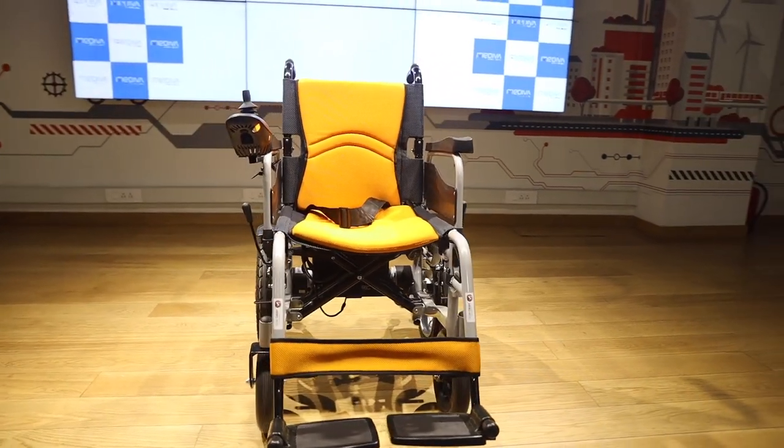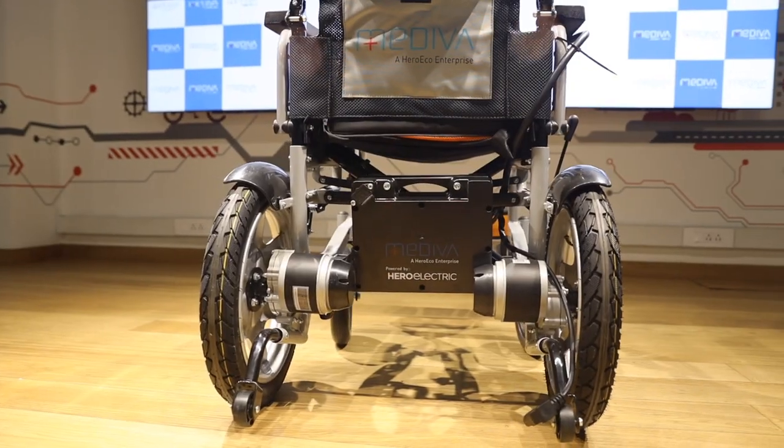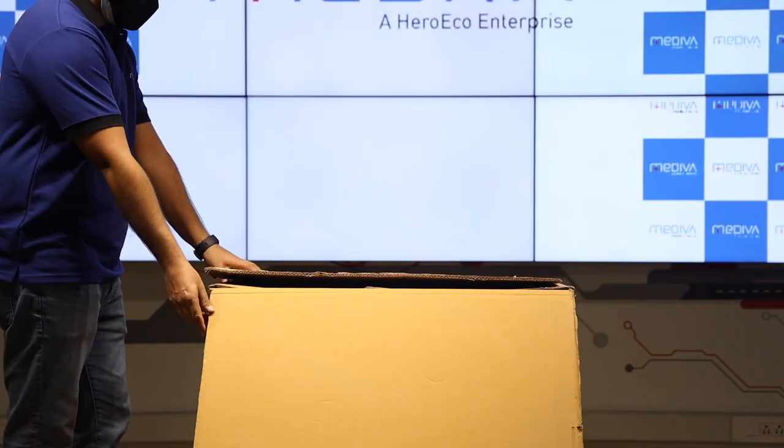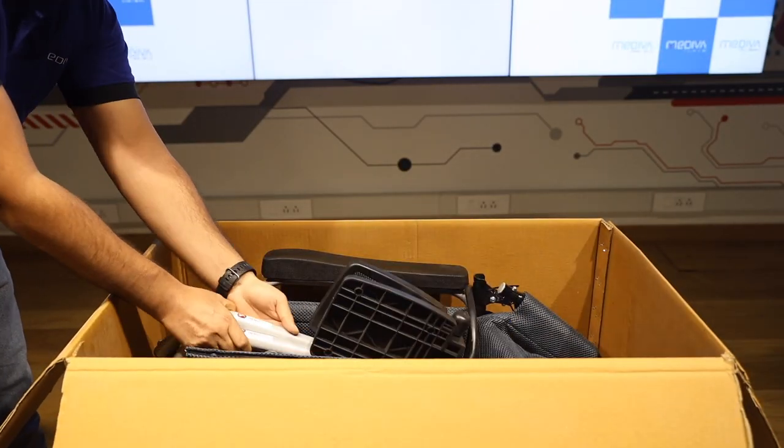Discover a new freedom with the Mediva Electric Wheelchair, designed to go anywhere with you. The Mediva Wheelchair is a lightweight, easy to assemble, foldable power wheelchair.